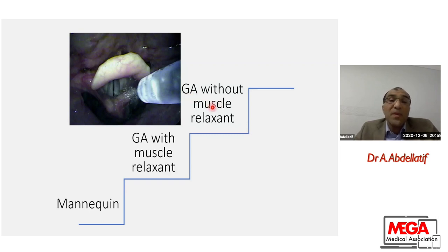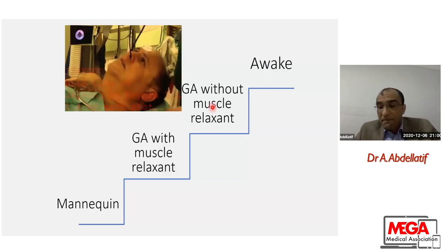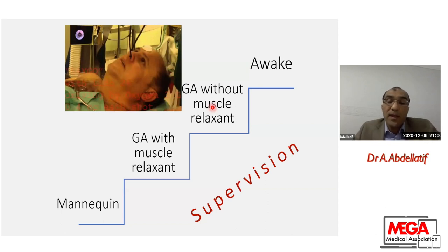I have to use a special airway to protect the fiber optic if the patient becomes light in the stage of anesthesia. He may bite on the scope and damage it. Then the last step, of course, is doing the patient totally awake. And of course, all these steps should be under supervision of experts.